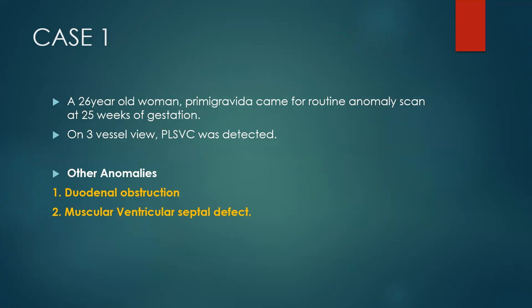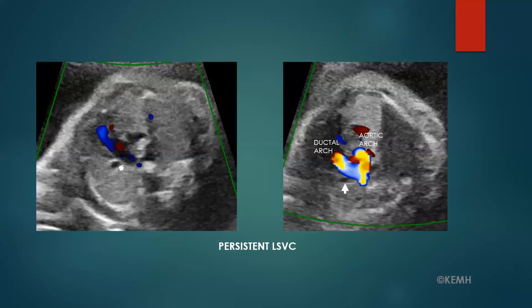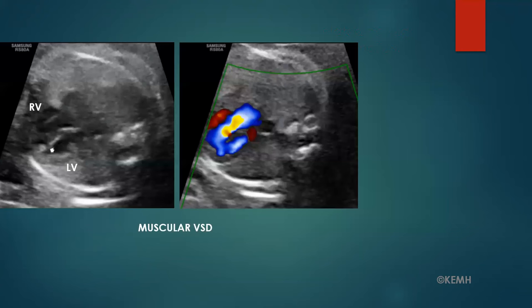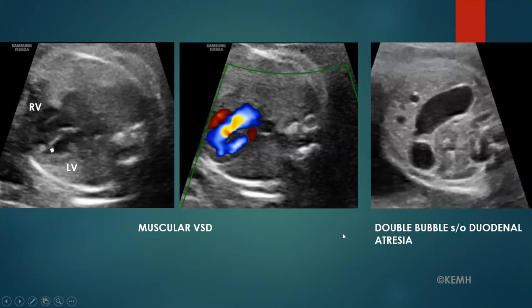Case 1 is a 26-year-old primigravida who came for an anomaly scan and PLSVC was detected. A muscular VSD and duodenal atresia were the additional anomalies. These are the images of PLSVC lateral to the ductal arch, the muscular VSD with flow from right ventricle to left ventricle, and the transverse section of the fetal abdomen showing a double bubble sign, suggestive of duodenal atresia.